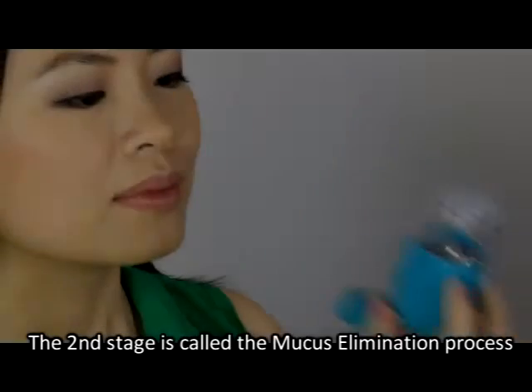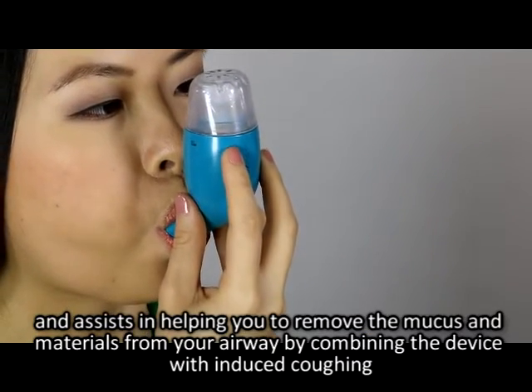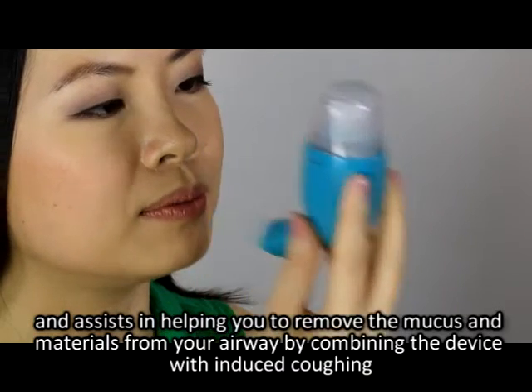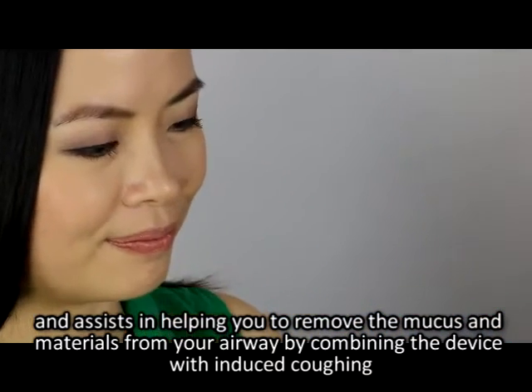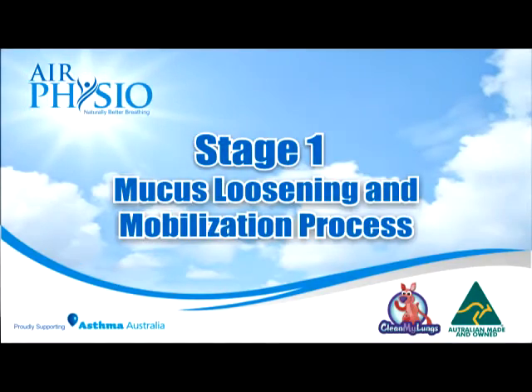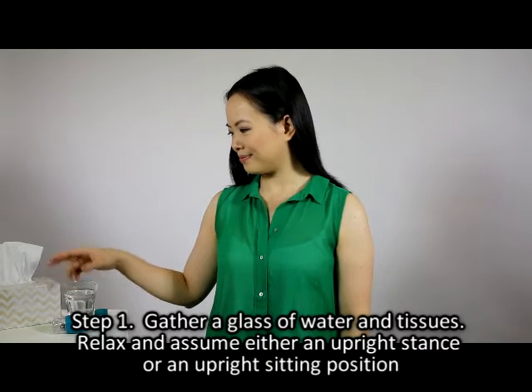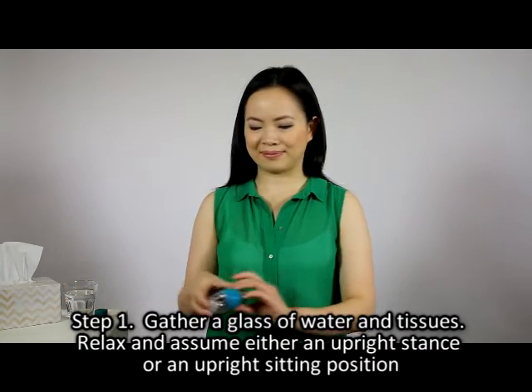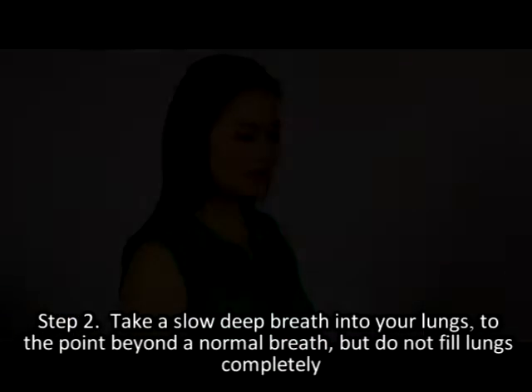The second stage is called the mucus elimination process and assists in helping you remove the mucus and materials from your airway by combining the device with induced coughing. Stage one — mucus loosening and mobilization process. Step one: gather a glass of water and tissues, relax, and assume either an upright stance or an upright sitting position.